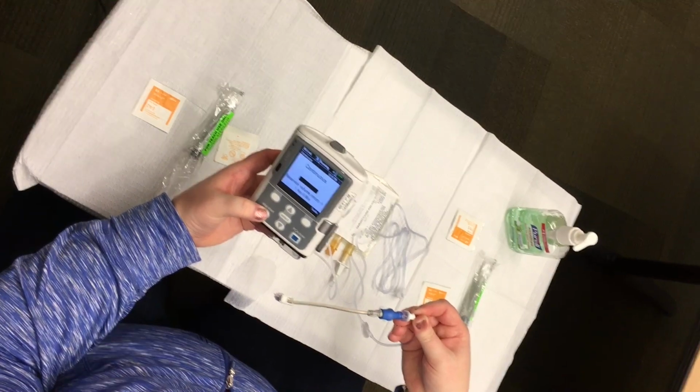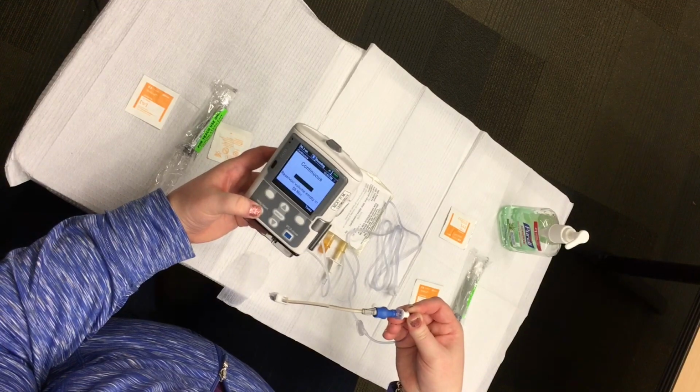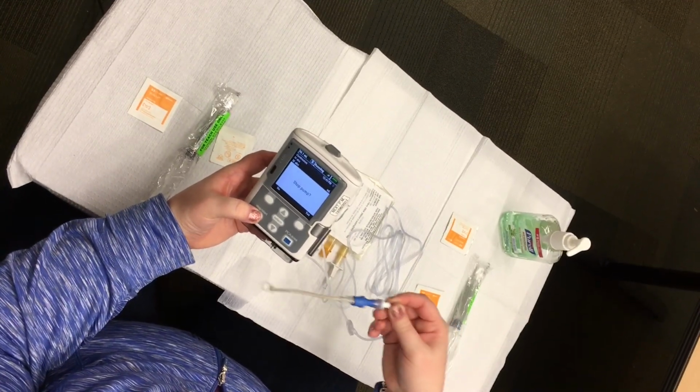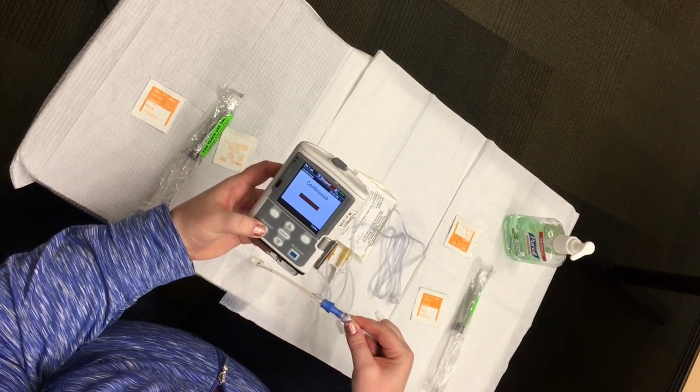When the infusion is complete, you will hit the stop-start button. The pump will say, do you want to stop the pump? Press the white button under yes. The pump will indicate that the pump has stopped.